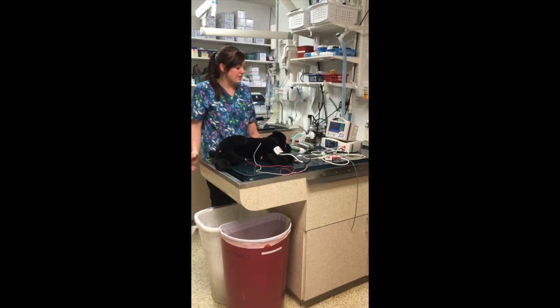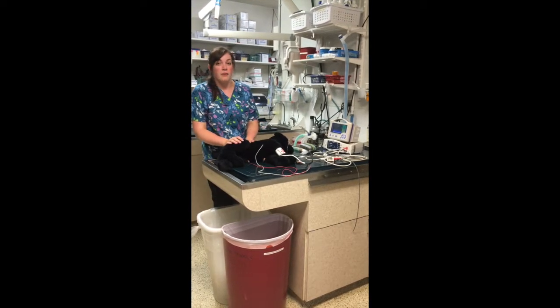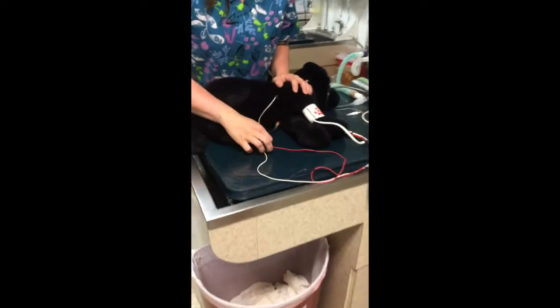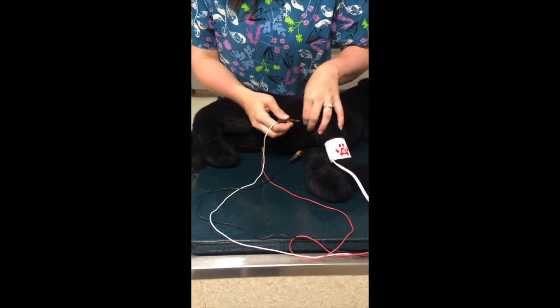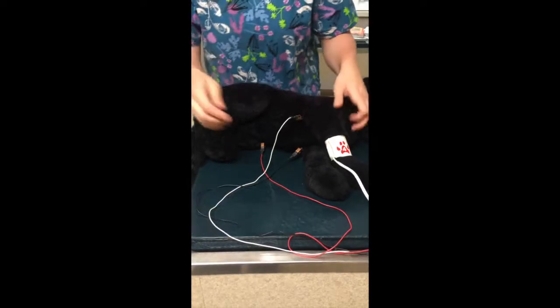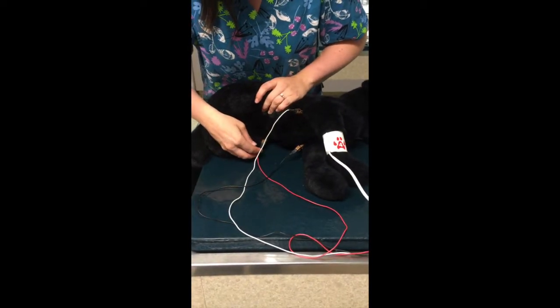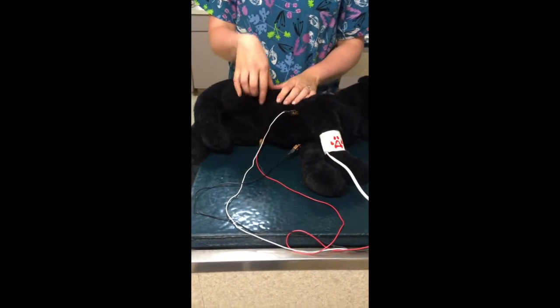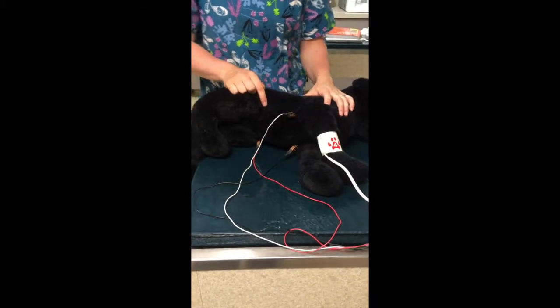Alright, I'm going to be discussing and demonstrating the different types of anesthetic monitoring for anesthesia. So first I'm going to talk about our ECG leads. So we have the white lead, and there's these little clamps. The white lead clamps on to the skin underneath the right arm. Black lead goes on the left arm. Red lead goes on the groin area on the left side. And if we had a green lead, which we don't here, it would go on the groin area of the right side.